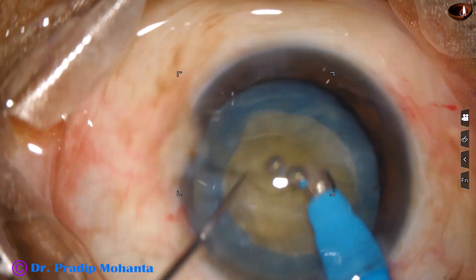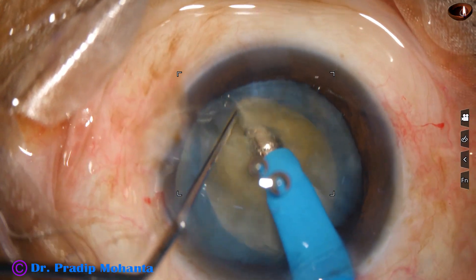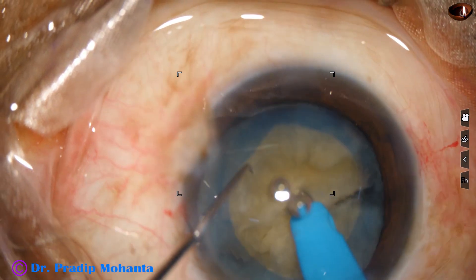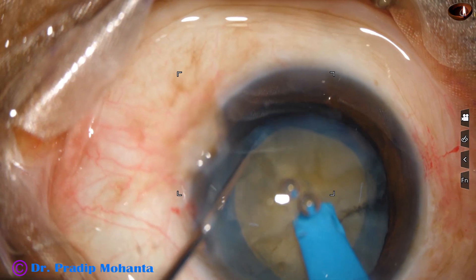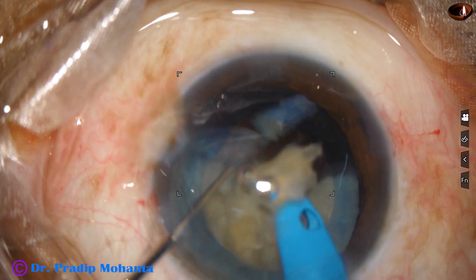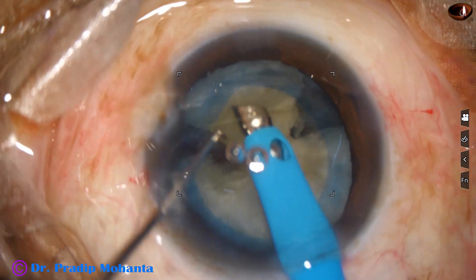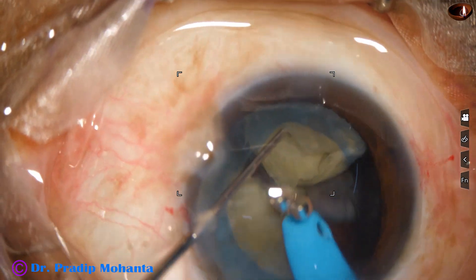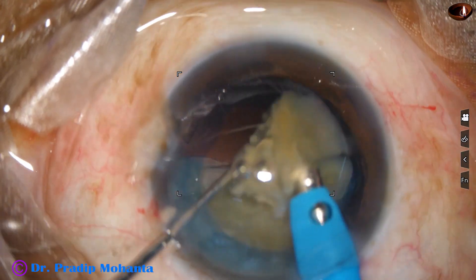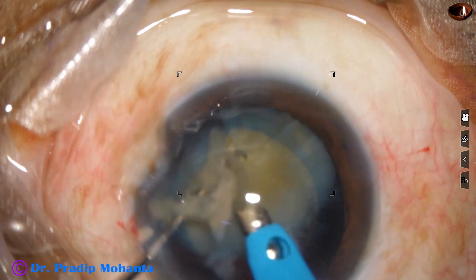Why bevel down? Because with bevel down I can hold the nuclear mass very firmly. With bevel up I cannot, because this is a free floating nucleus. So whenever the nucleus is free floating, if the bevel is down, it goes directly into the substance of the nucleus and we can hold the nuclear mass very firmly. But we have to judge how deep to go.